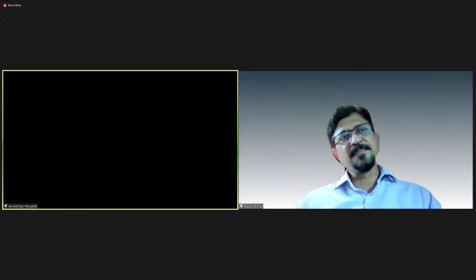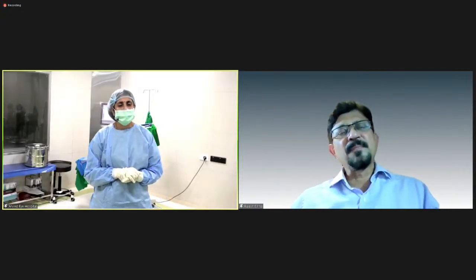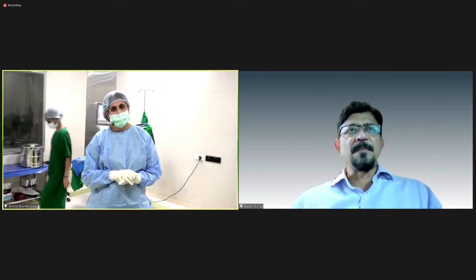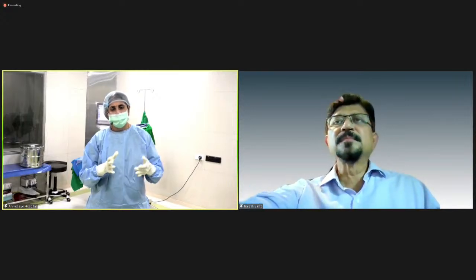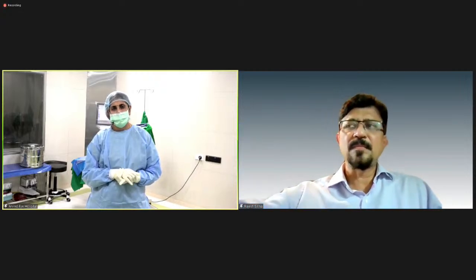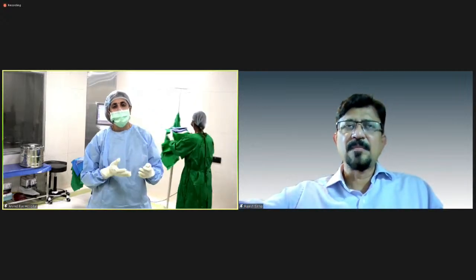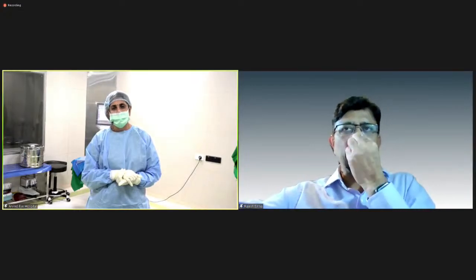Yeah, so I personally don't do many pediatric cataracts myself, but the pediatric ophthalmologists normally do prefer a clear lens here as well. I am not sure. I don't think it's any fear or anything about the aspheric, the yellow platform. But again, I think since there's no evidence in terms of benefit, that's the reason why it's not being used widely in children.